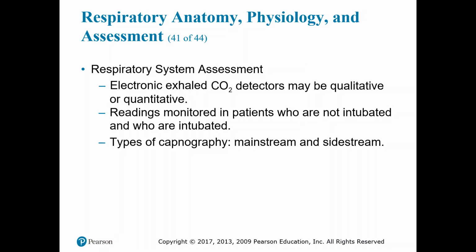Each has its advantages and disadvantages, as with anything else. With mainstream capnography, the infrared light is shone through the gas within the patient's circuit. So the actual sensor is at the patient on the breathing circuit, as close to the patient as they can get, shining the light through and getting its readings at that point.